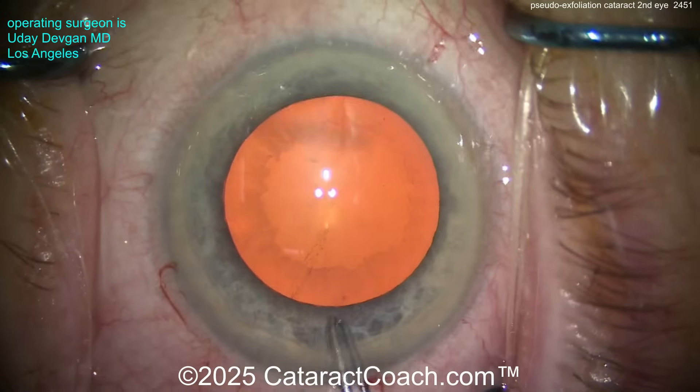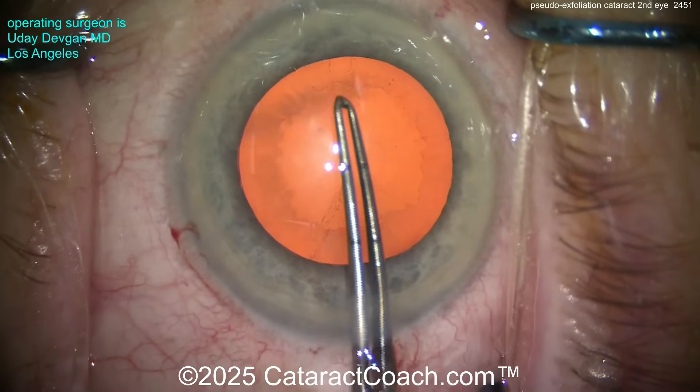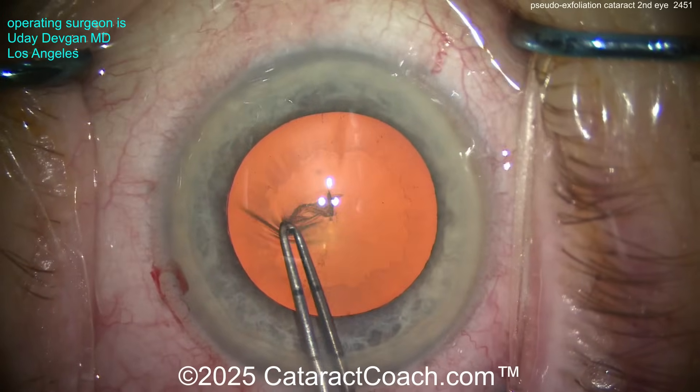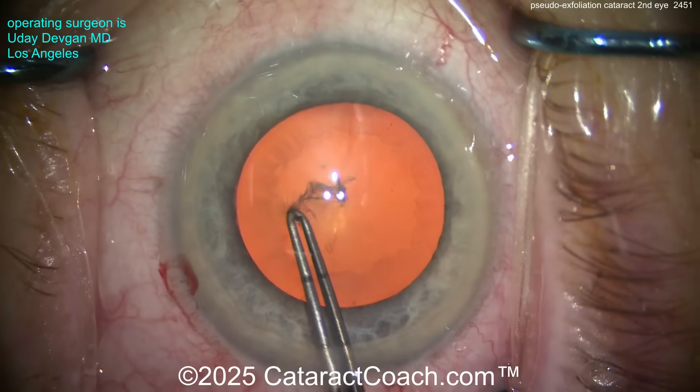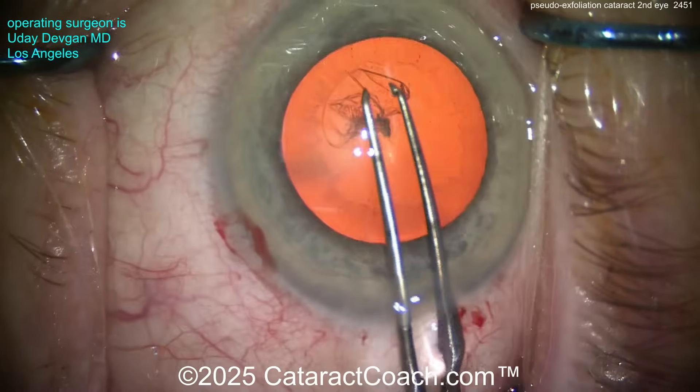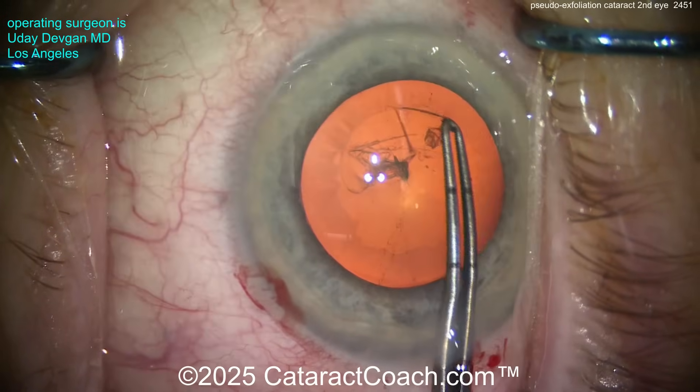My forceps here are marked off at two and a half and five millimeters from the tip. People sometimes email me asking which forceps to use — it's on the Cataract Coach website. If you go to cataractcoach.com and click on the about link, it has everything about me, including my instruments that I use. Now let's get back to this case.